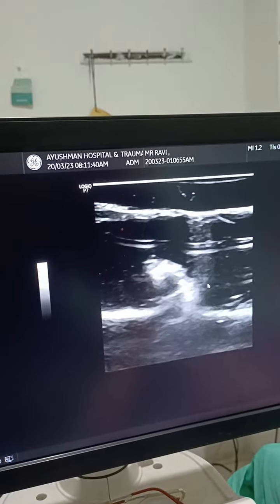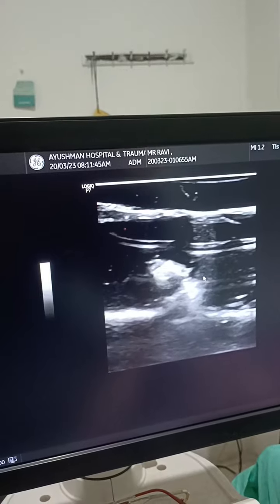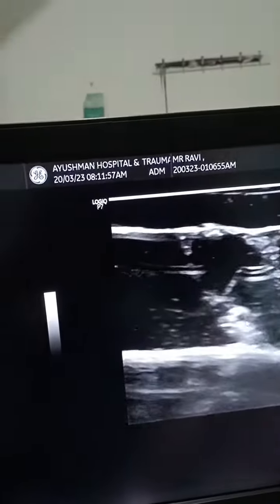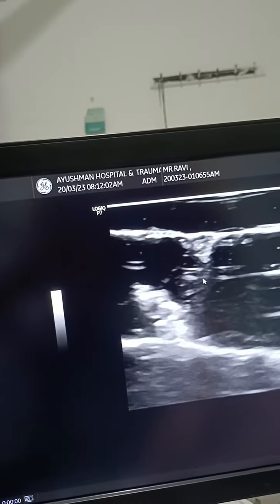I am going from lateral to medial side, standing behind. That's my approach for Brachial Plexus Block. And if we just show the probe and rotate the probe — now you can see something. This is our plexus we have to block, and we will be going from lateral to medial.